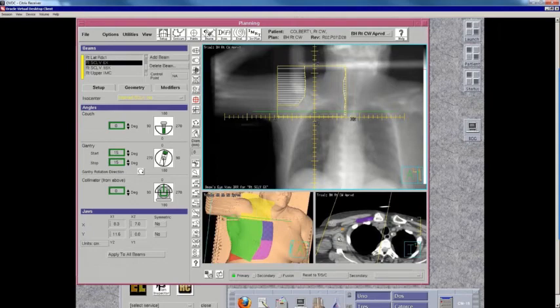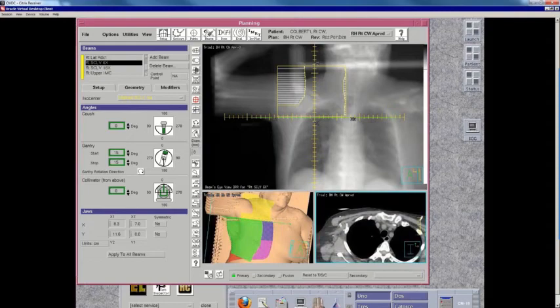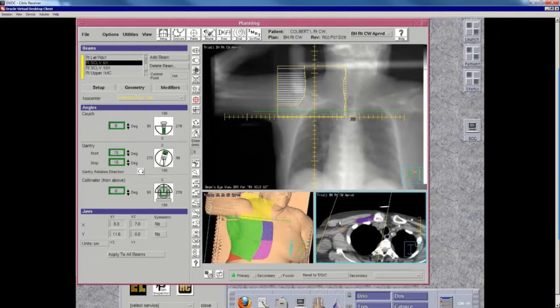In our practice, when we're quote unquote treating the axilla, what we do is we actually contour this whole axillary space, and then we'll add a supplement either from the front, an anterior axillary supplement, or the back, which is often called a PAB or posterior axillary boost, to make sure that the minimum dose to the axilla is 45 gray. And one way to think about that is you're trying to get your 45 gray isodose line to come down to here, the anterior margin of the subscapularis muscle.